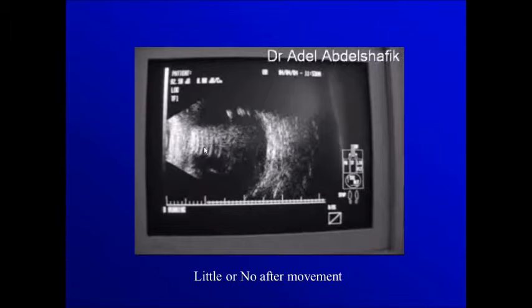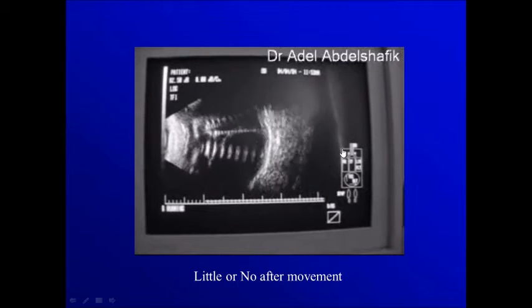If you wonder what this is, it is an artifact — in fact a reflection — indicating the presence of an intraocular lens here.